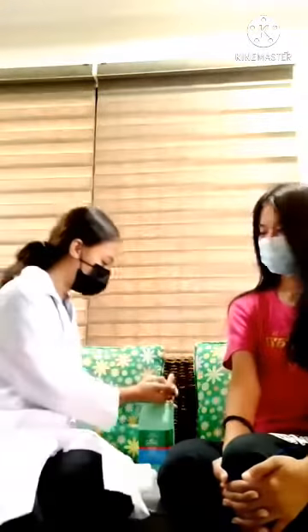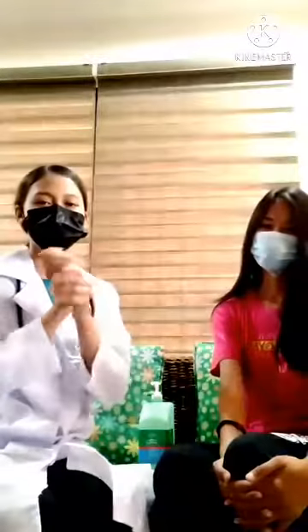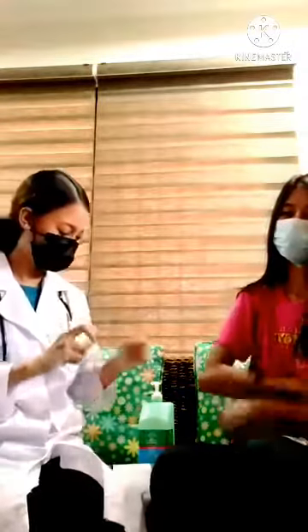Assessing oral temperature. So before anything else, perform hand hygiene to remove all the microorganisms. And then after that, wear our non-sterile gloves.